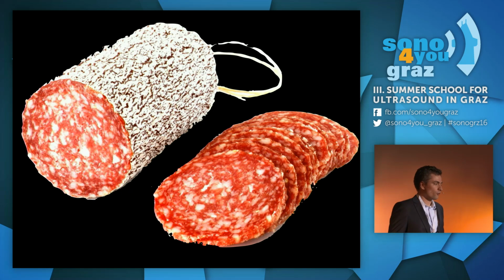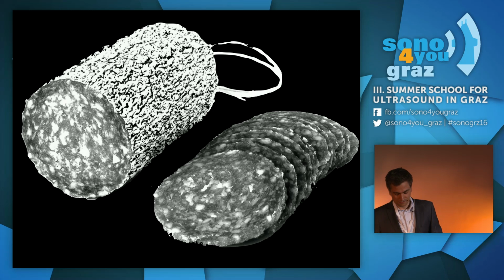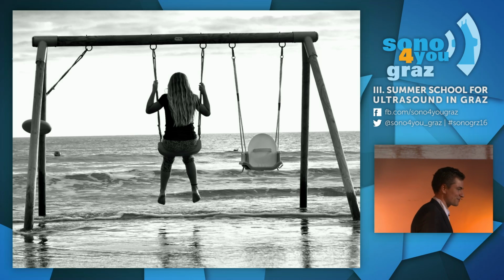You have already learned about cross-sectioning. Everybody who has learned radiology knows cross-sectioning. It's like a salami, but with ultrasound it's black and white. It's just slicing up the body and looking at the different slices and analyzing them. But you only know CT. And CT is like the swing. It's backward, forward, backward, forward. And the same with MRI, you have the standard planes, it's backward, forward, you can scroll through.